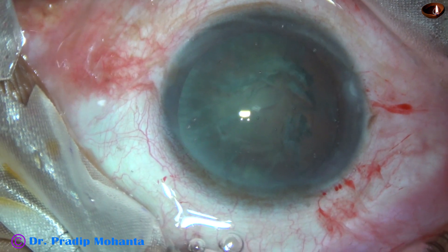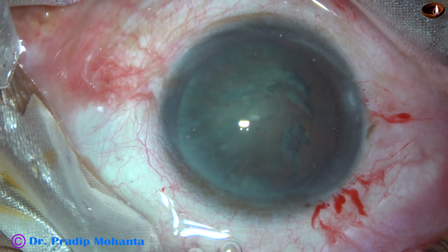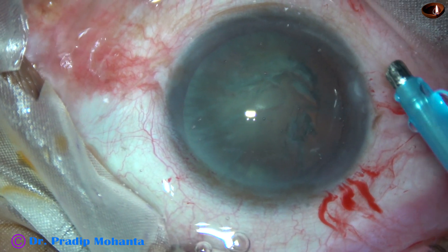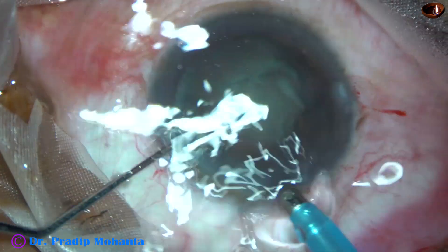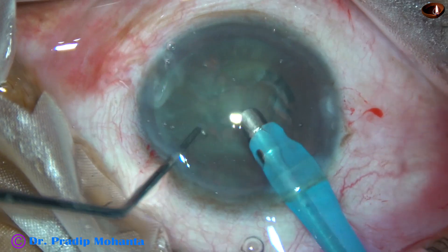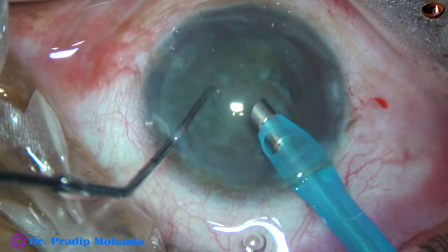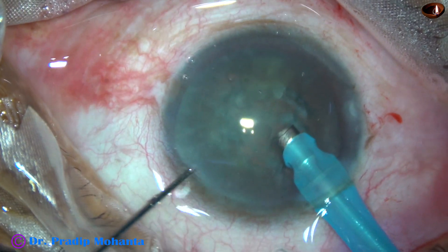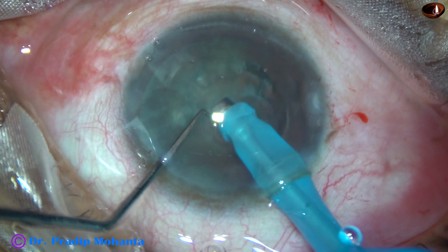Inject some more visco — this is 2% HPMC. And now the FACO probe is to be introduced into the anterior chamber. Irrigation is on, and with its bevel down, the FACO needle goes into the anterior chamber. Some superficial cortical lens matter and some epinuclear lens matter is removed for better visibility. Now the handpiece is turned to make the bevel of the FACO needle up towards the corneal endothelium, and now start sculpting.